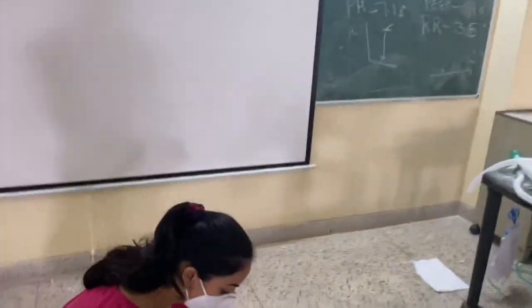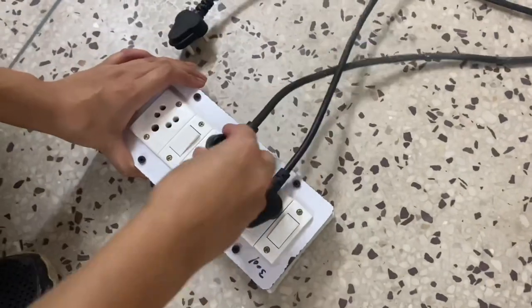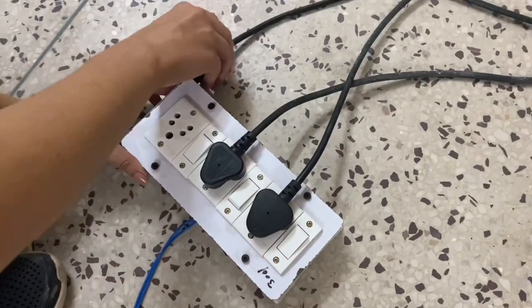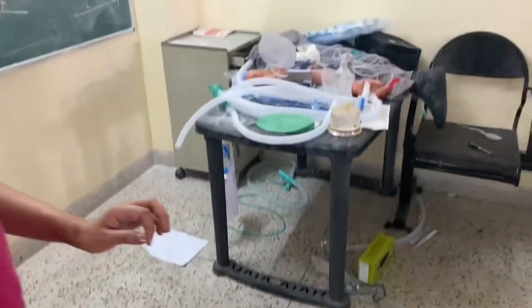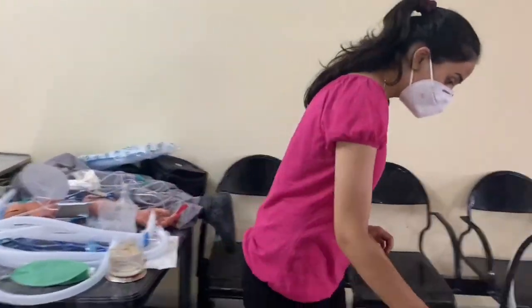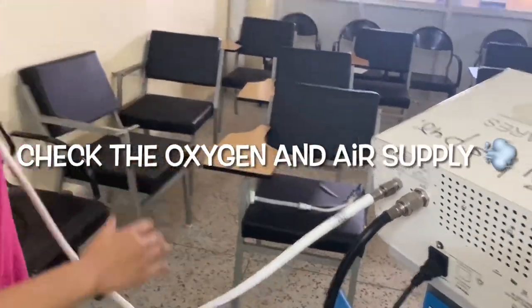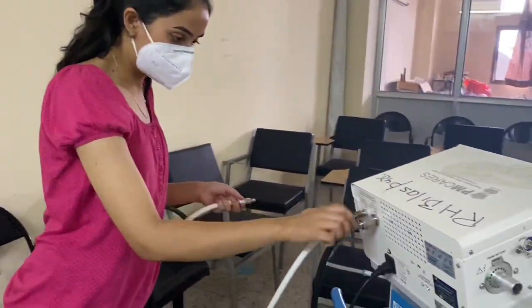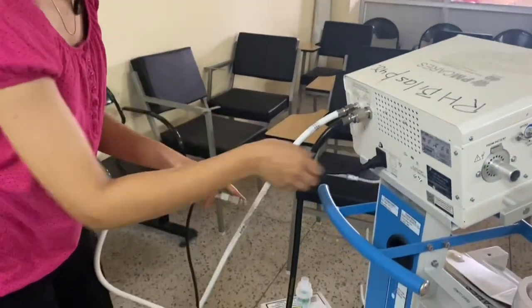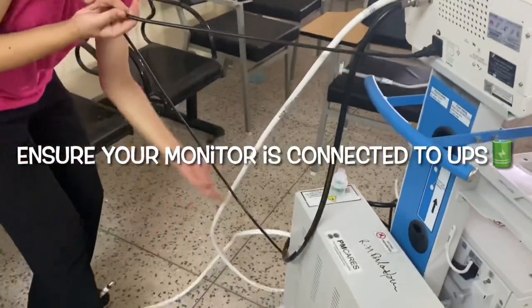To start a ventilator, the first thing is to ensure a power line for all three components: the humidifier, UPS, and the compressor. If you are operating a PM Care ventilator — if you are operating a Hamilton ventilator, then you need to ensure just one plug. Next step is to connect the air and the oxygen port to the central supply, and make sure that the monitor is connected to the UPS.